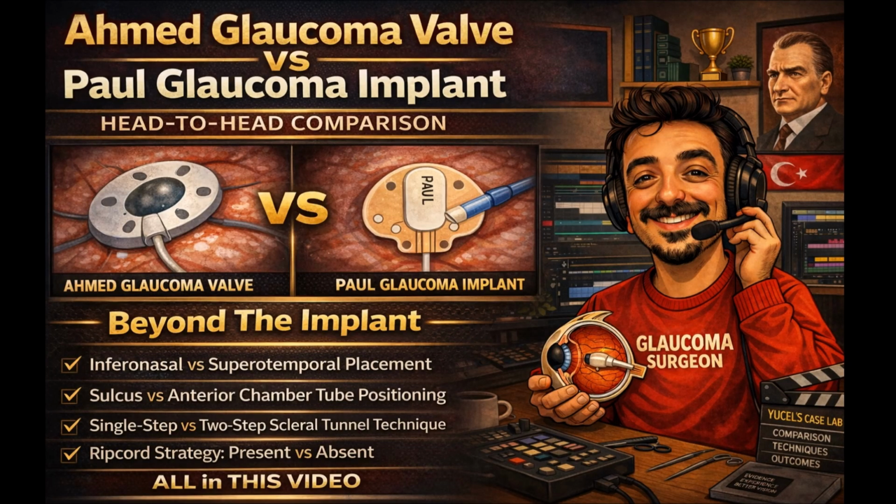In this video, I will present a head-to-head surgical comparison between the Ahmed Glaucoma Valve and the Paul Glaucoma Implant, highlighting how differences in implant choice are accompanied by differences in tube location, quadrant selection, scleral tunnel design, and flow control strategy. Let us start with the first case.